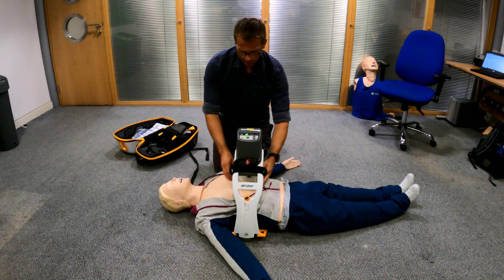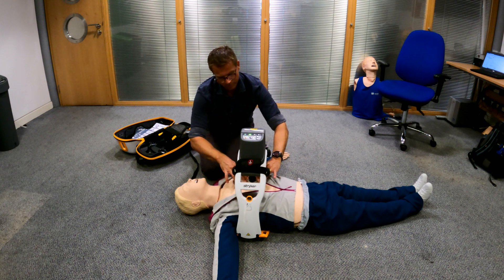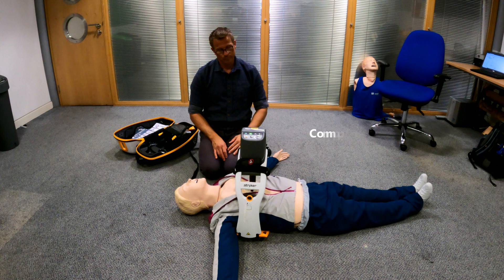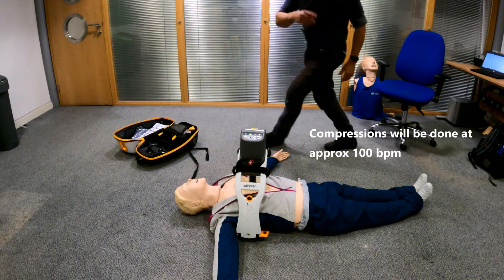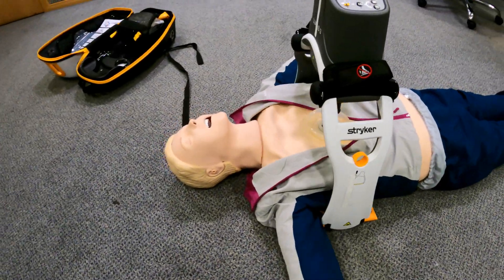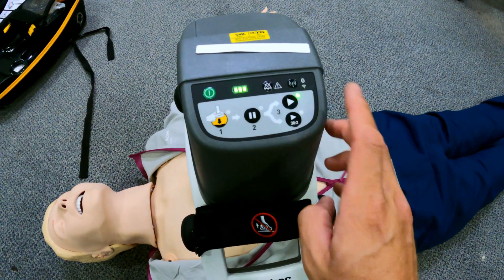You then make sure it's high enough on the patient. You need this bit — the plunger — sitting right in the middle of the chest. The plunger then comes down, you tell the machine that you're ready, and you ask it to start compressions. It'll take over CPR for you. It automatically measures the depth of the chest it needs to compress to and will just carry on as long as needed. There are indicators to show how long the battery will last.